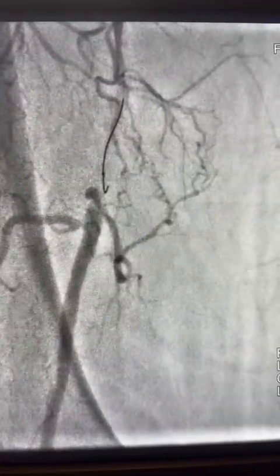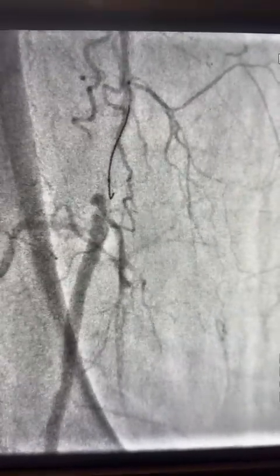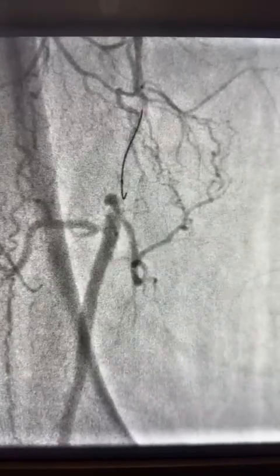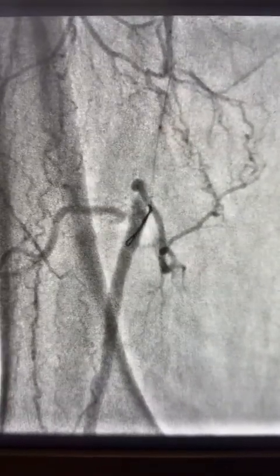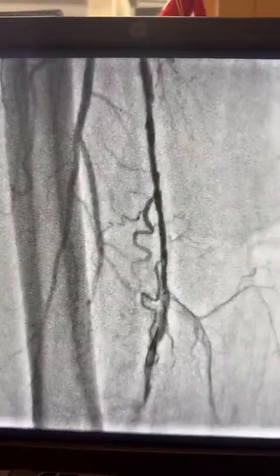The wire did not cross the distal CTO segment — here you can see it going through a false lumen and into the dissection plane. I then did angioplasty and intravascular lithotripsy using a 4.0 balloon to improve flow distally, but we still have the CTO segment remaining.